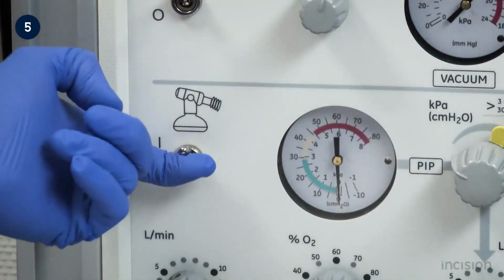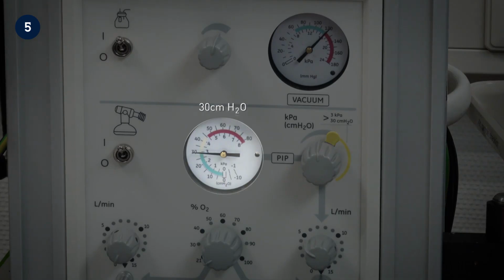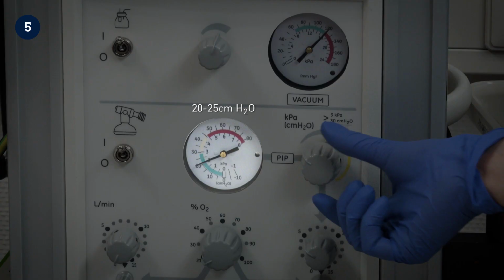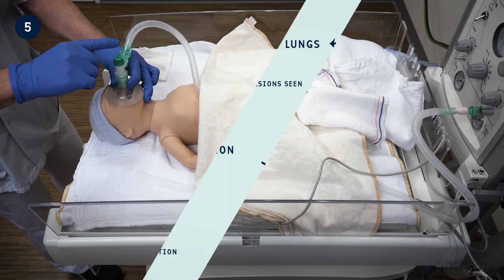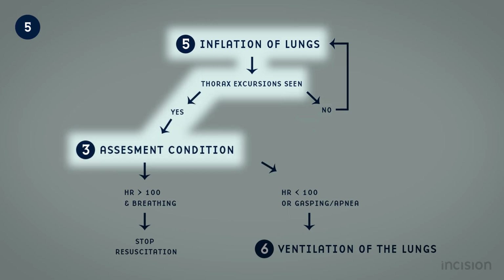The correct ventilator settings for a baby at term is 30 cm H2O. Note that in preterm infants, ventilation pressures should not exceed 20 to 25 cm H2O. During the resuscitation, the condition of the newborn is reassessed every 30 seconds. If chest expansions were not visible, inflation of the neonatal lungs is repeated before moving on to the next step. If chest expansions were visible, the subsequent steps are dependent on the results of the reassessment.